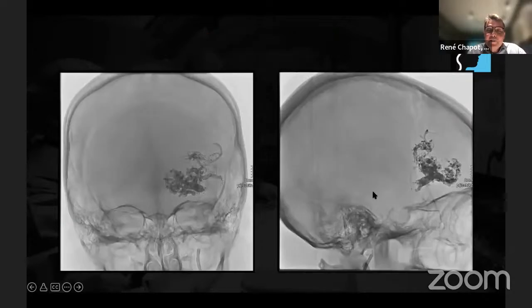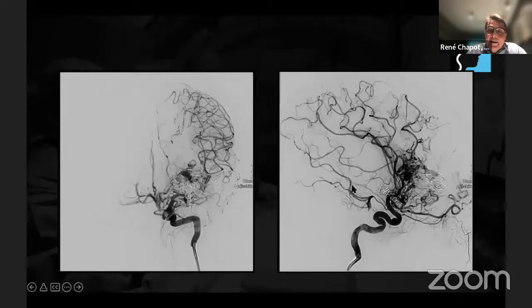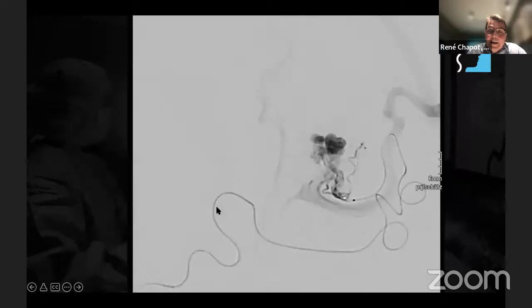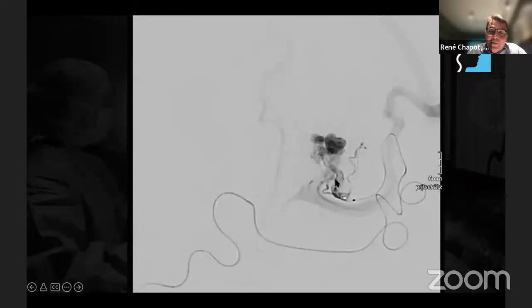So here are some, I would say, transarterial embolizations. I won't go into this detail. And now we reduced it significantly, but the AVM is still there, fed by the left ICA, some frontal branches, and by some indirect frontobasal branches coming from the ACOM complex. And this here is quite well accessible. It's not completely straight, but you can put a magic, you can arrive here. And the question which is raised here is, can we occlude this? Where should we stop with occlusion?